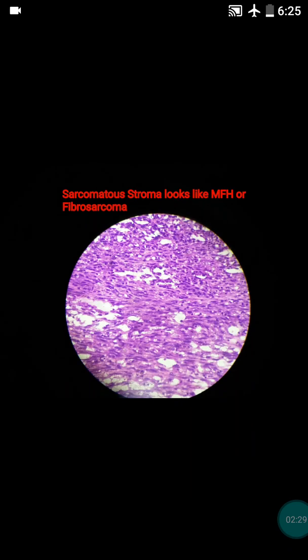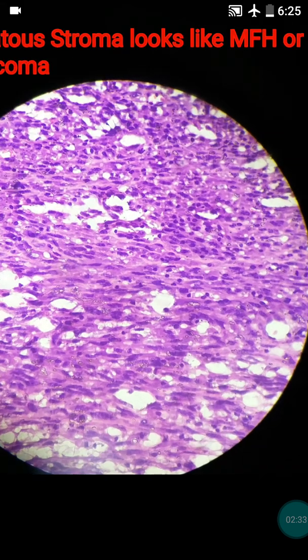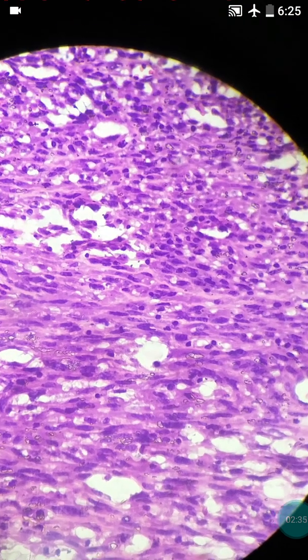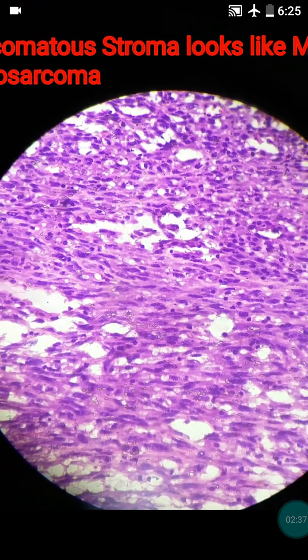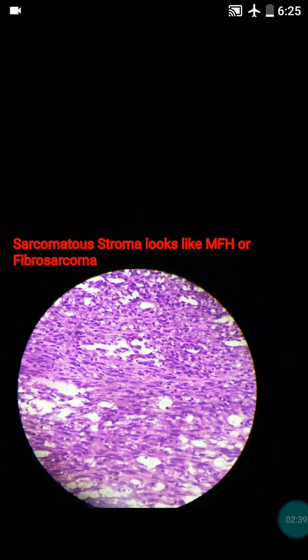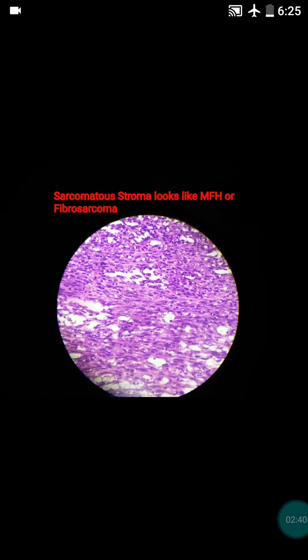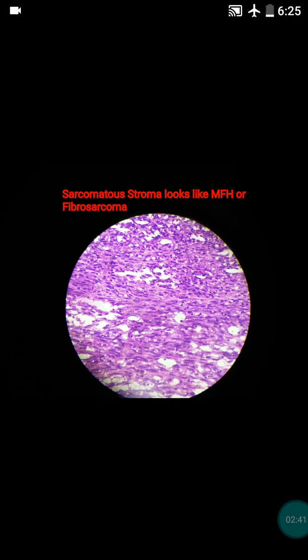In our case, there was marked nuclear pleomorphism and atypia visible in the high power view, and there was greater than 10 mitoses present. There were also necrotic foci, which are not seen in this section but were present in the specimen.